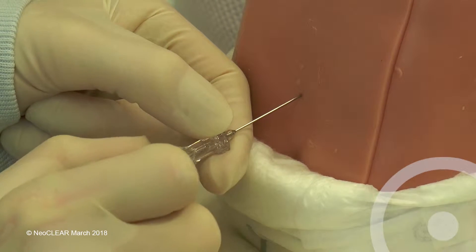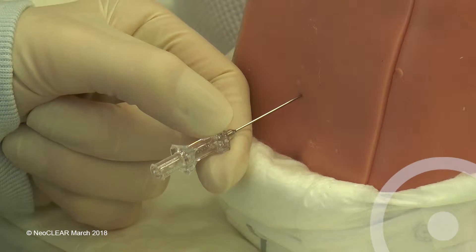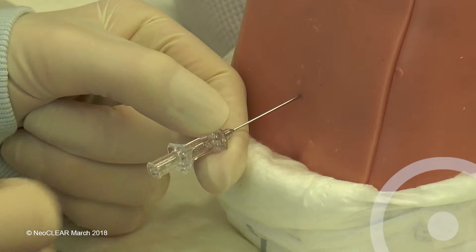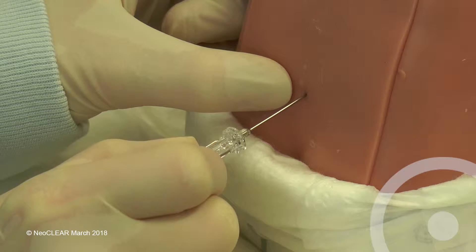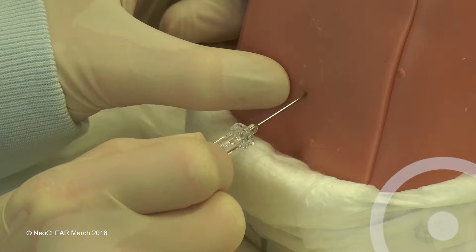For early stylet removal, remove the stylet once the needle is through the skin and subcutaneous tissue. Slowly advance until CSF is seen in the hub of the needle.